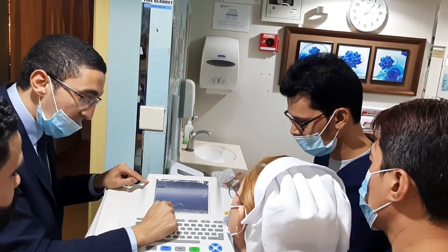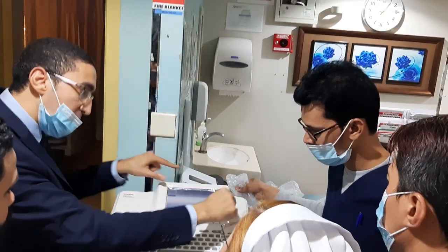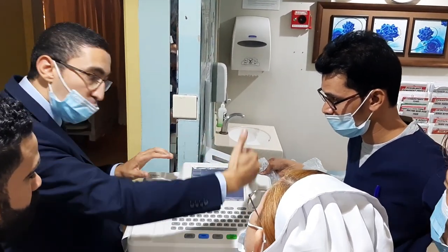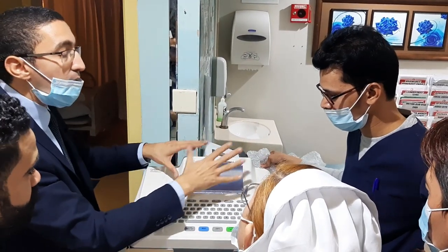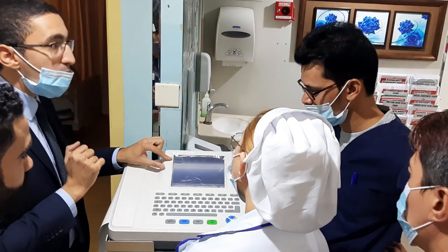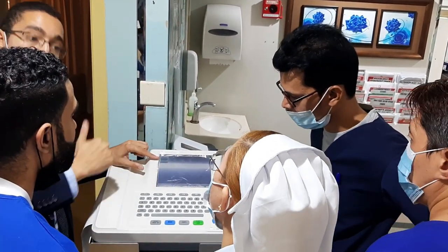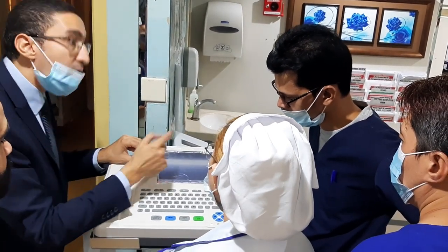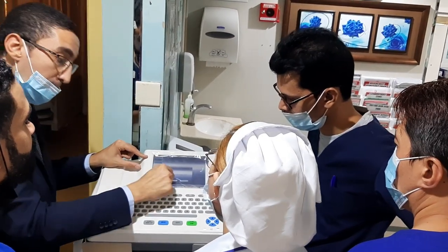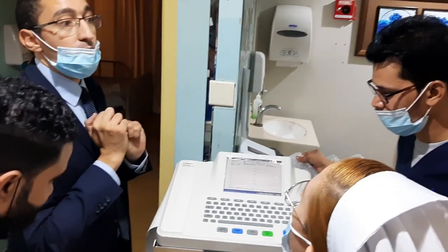Here it will appear the name of the file. You are asking about the history. All history is here. Page number 1, page number 2, page number 3, up to 1000 files. You asked me how to copy and reprint another patient. Press here, then you can print. Then press yes. It will give you a preview, so you can print.